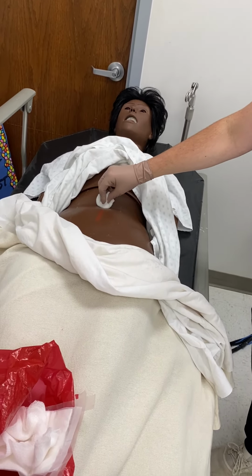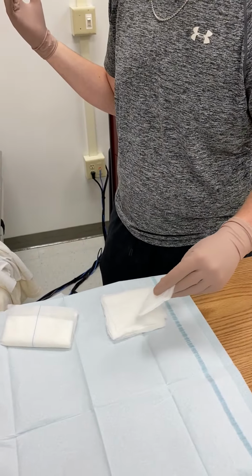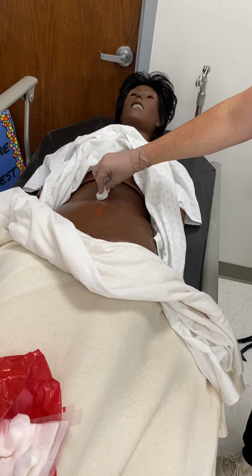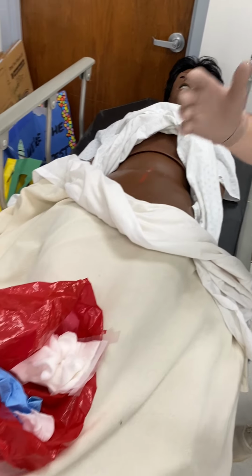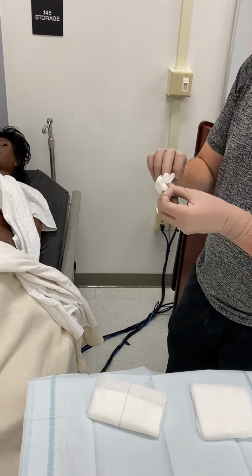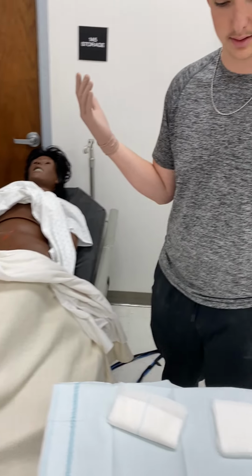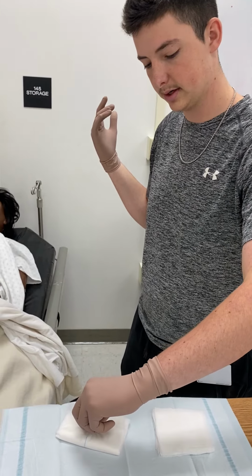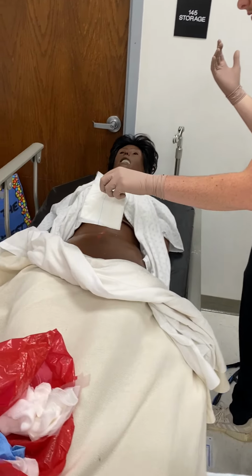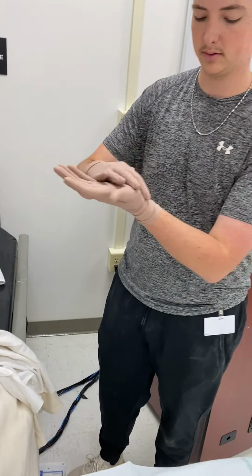Okay, with the cleanest, sterile portion. And to the right again. And finally, okay. Now this is clean. This hand is contaminated. I will now unfold my sterile dressing. Placing it on top. Positioning it. Perfect. Okay. Now I will remove my gloves.